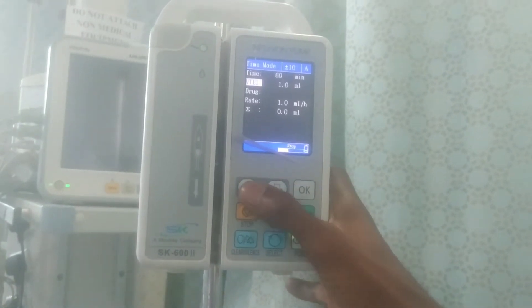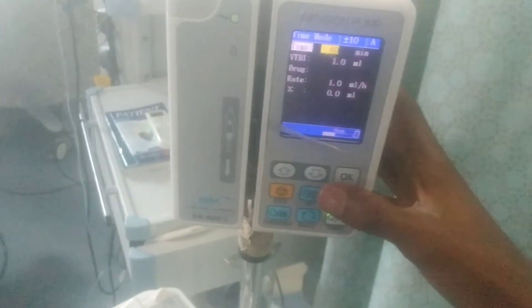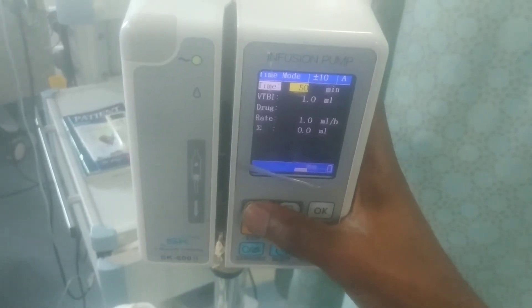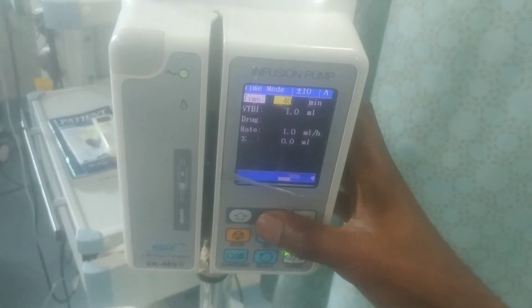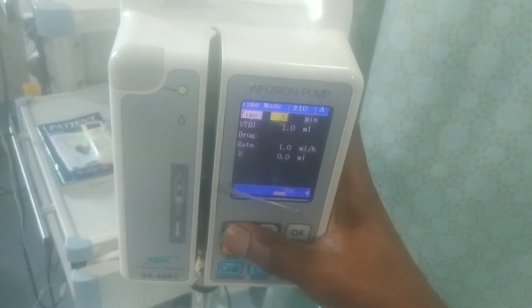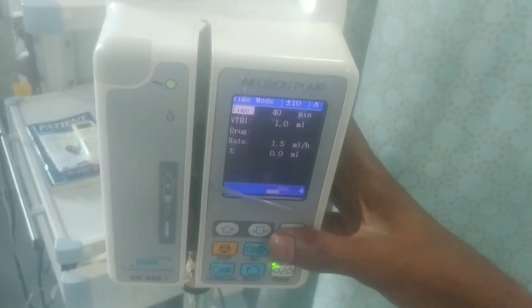This is the timing setting. You press on it and then set the time — how long you want the delivery to run. Is it 30 minutes, 20 minutes, 10 minutes, or 40 minutes? You set the time according to how you want the delivery to go. When you are done, click OK.